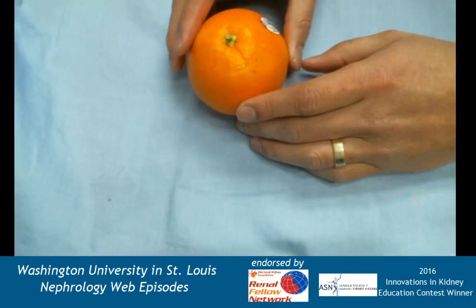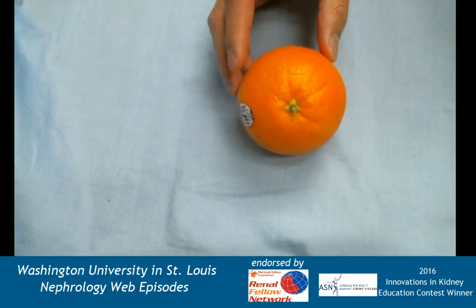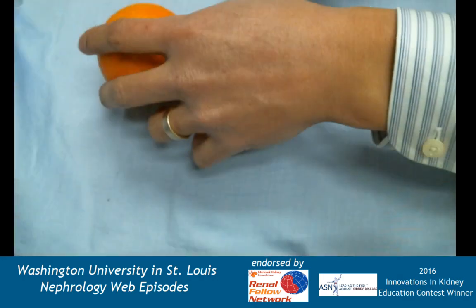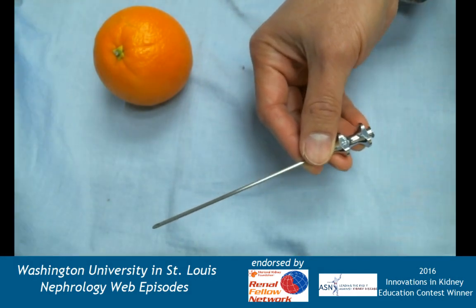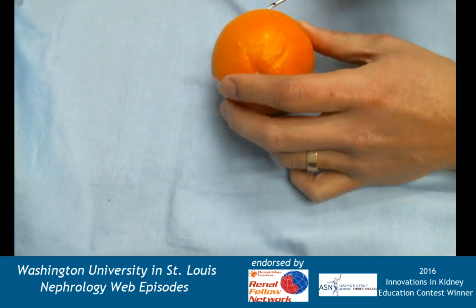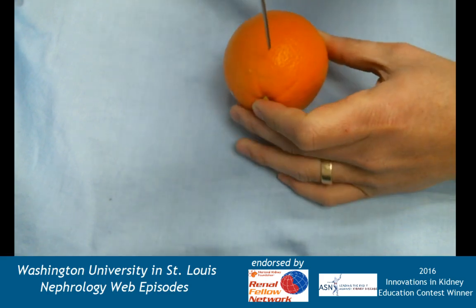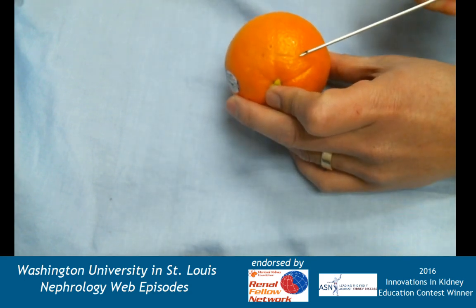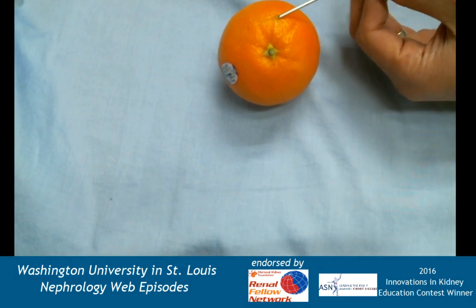Now for the hands-on part — here's an orange. I've already taken a few cores as you can see. This is easier to do with an apple but I couldn't find one today. Let's start with the Vim-Silverman. I'll hold the orange as if it were a kidney. An important point: you don't want to go straight up and down, because you'll end up getting mostly medulla. You want to come in at an angle — tangentially to the lower pole at the renal capsule.